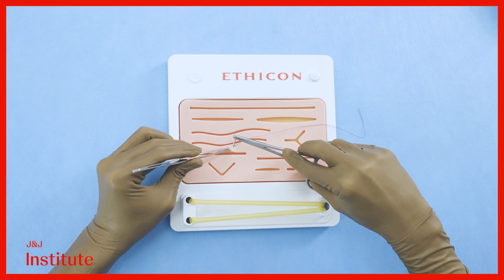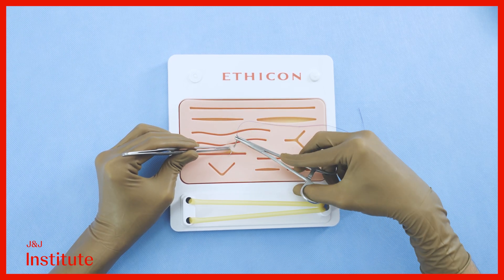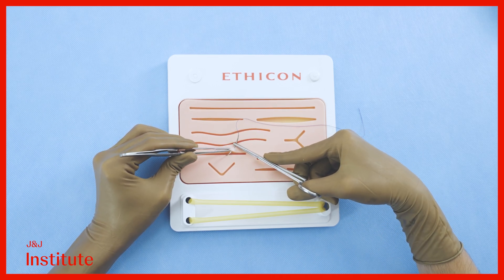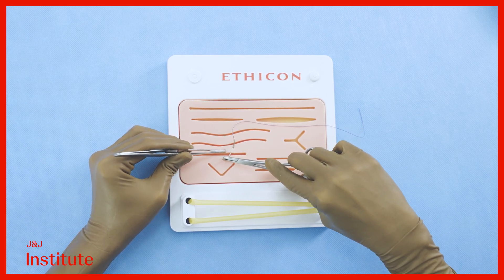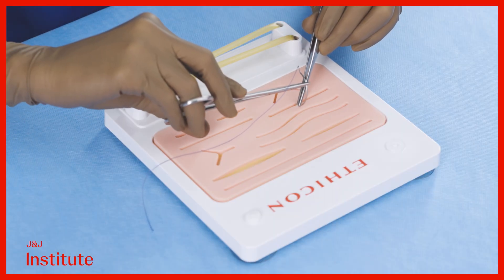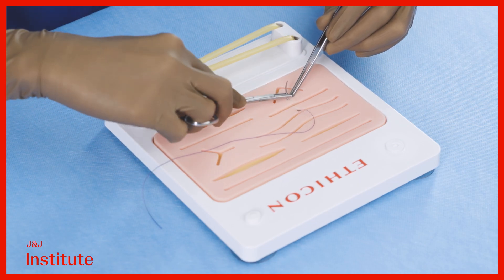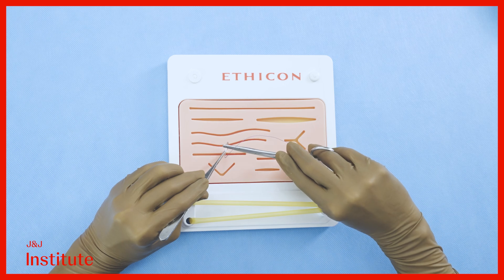Remember, the passage of the needle through tissues is meant to follow its curvature. This is done by gentle supination and pronation movements at the wrist. Not following this curvature and tugging the needle across will lacerate the soft tissues and impair healing. Always insert as well as retrieve the needles from the soft tissues at a right angle.